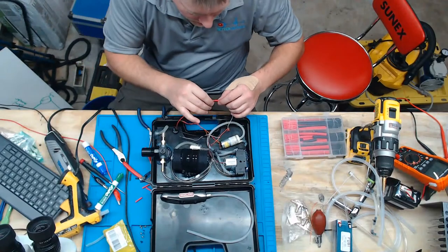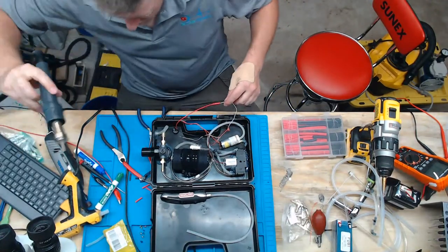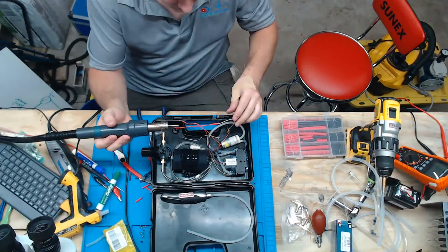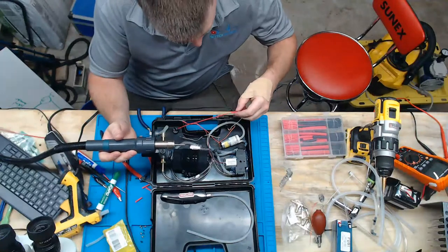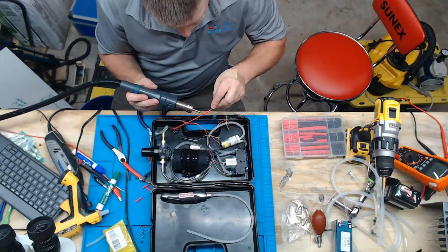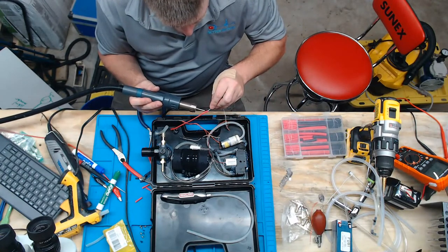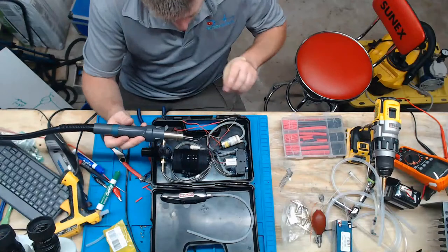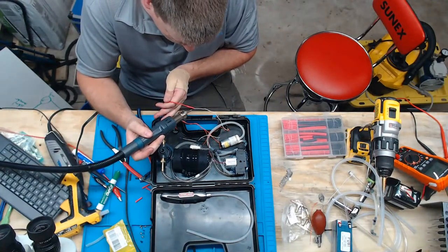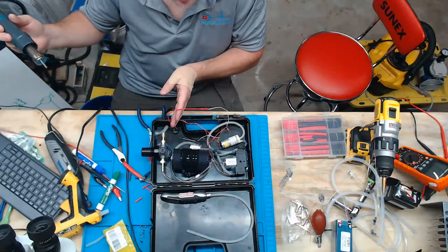And I've got my quick hot air station all set up. You can see my lights flickering. I don't know why it does that. It's the weirdest thing. Okay. Right there. There she goes, man.